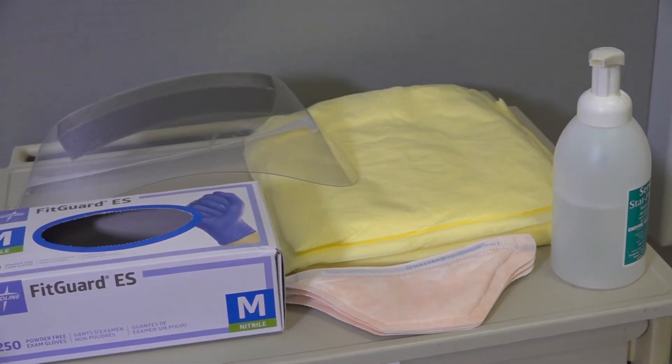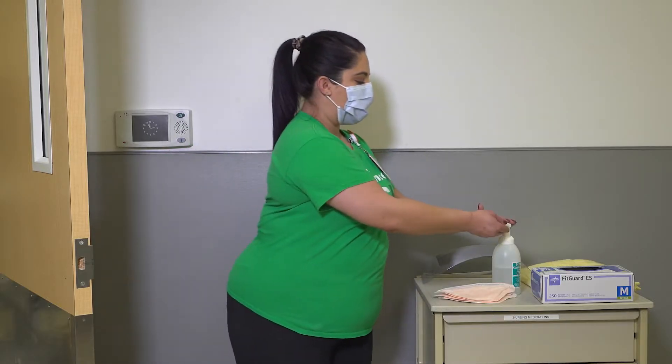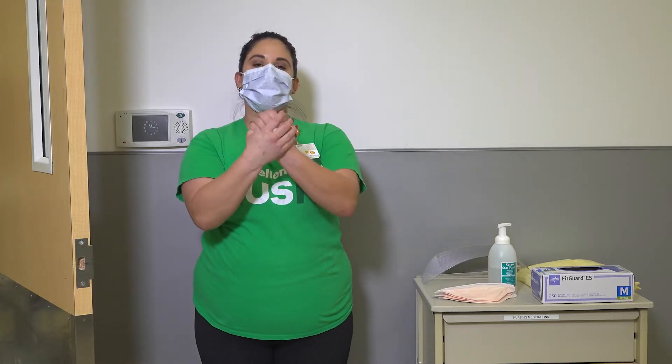For this video, we will demonstrate using an N95 respirator. First, perform hand hygiene. Wash your hands thoroughly, including the front and backs of the hands, the wrists, and in between the fingers.